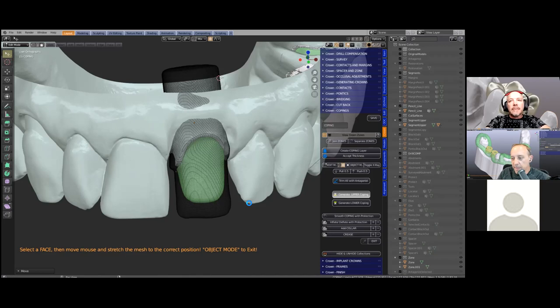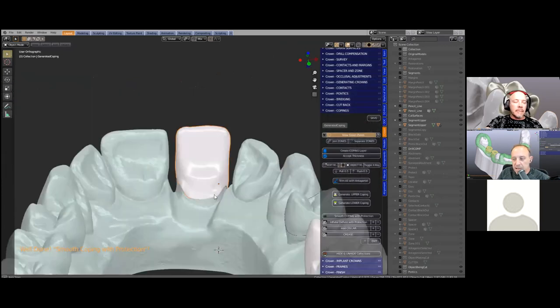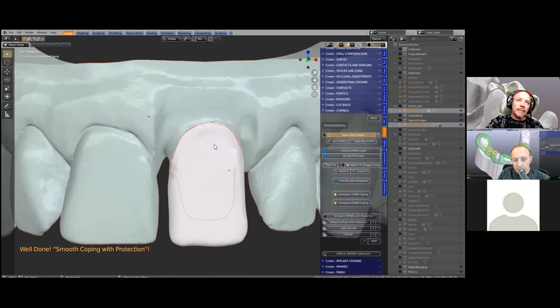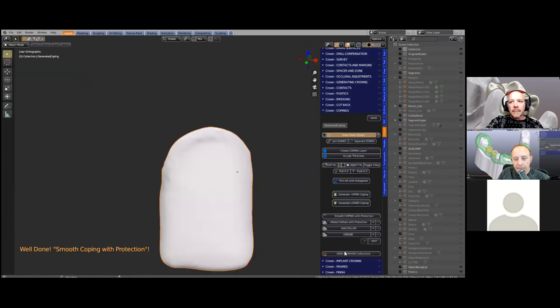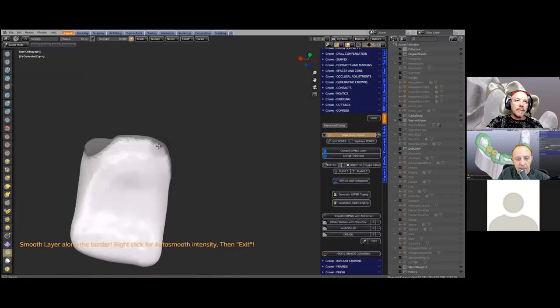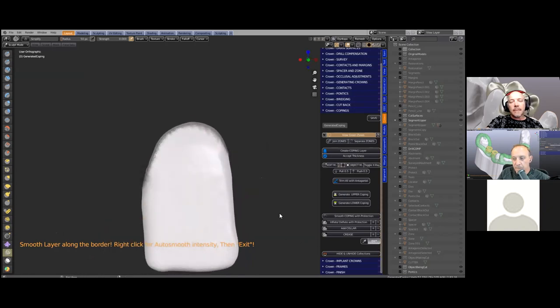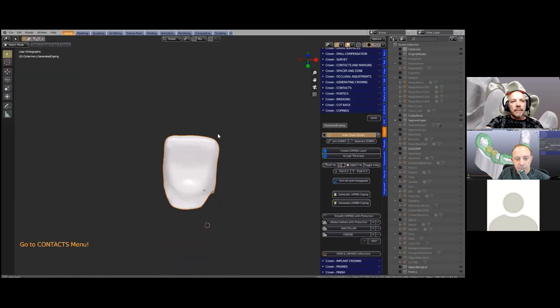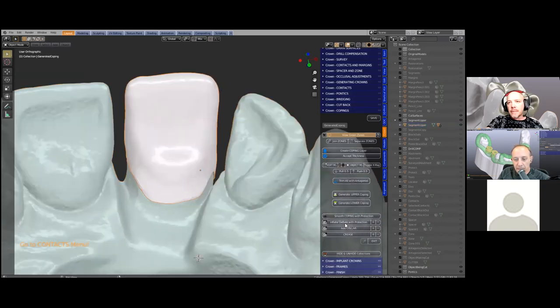This will actually generate the coping as such — here we go. It's adapted nicely to the margin and the mesh looks pretty good. One can smooth that down again — the inner fitting surface is protected. Excellent — ready for export.